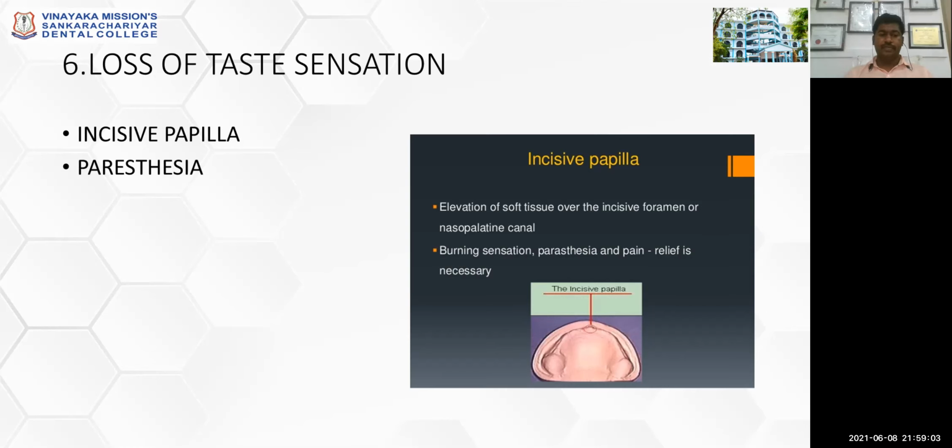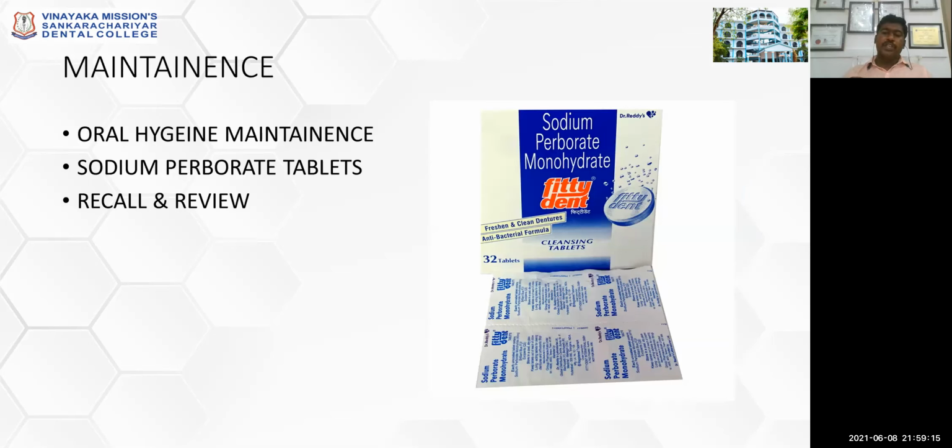Another important thing which we fail to tell the patient is how to maintain a denture. We ask the patient to come after complete denture insertion: after 48 hours, which is the first appointment, then after a week, and then after 6 months. This is a protocol which you should follow during this procedure.